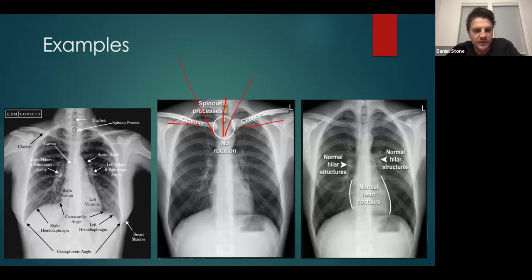Then there's a little bit of anatomy. You want to make sure that you're also trying to identify any major structures within the actual mediastinum. After looking at the mediastinum, you want to look at the heart and make sure that the heart looks appropriate. It's a PA view, which this is, because you can tell that the clavicles are angled. Want to assess for cardiomegaly. And then you can work your way out to the lung fields.